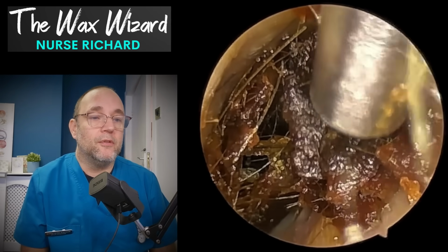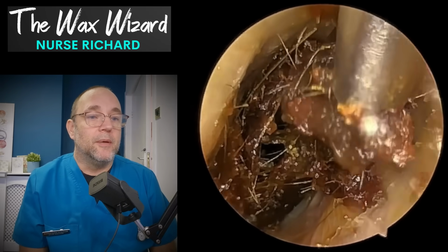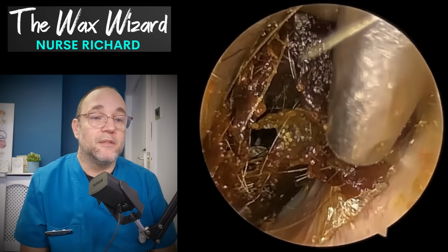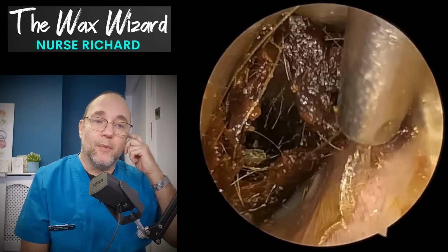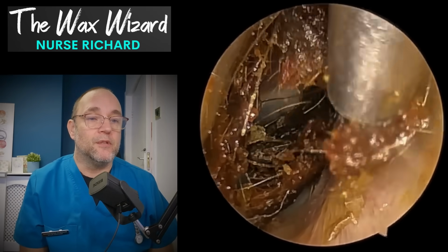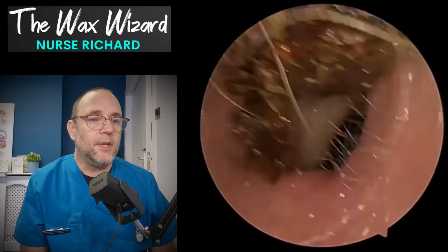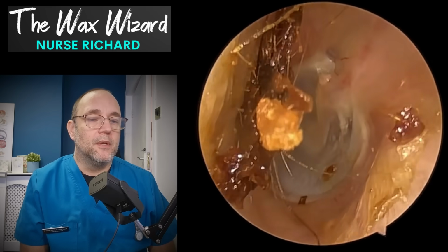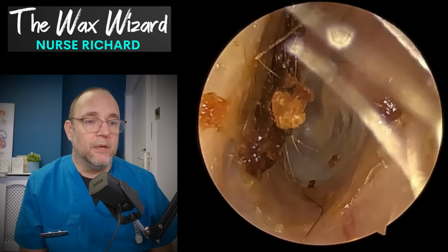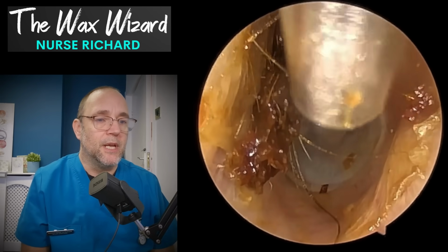Because this chap, other than not being able to hear very well, he didn't have any symptoms at all. Just had a bit of skin and wax in both of his ears, both pretty blocked up. And when we removed that, he reported being able to hear again a lot better, pretty much straight away. But it was an odd one, this, and it wasn't easy to spot. And again, that's the good thing about these endoscopes here, ordinarily you might not be able to see this because it's a really small pulsing area.